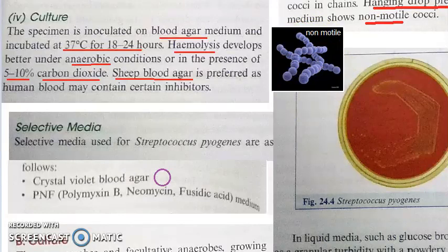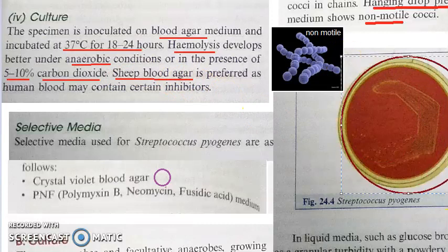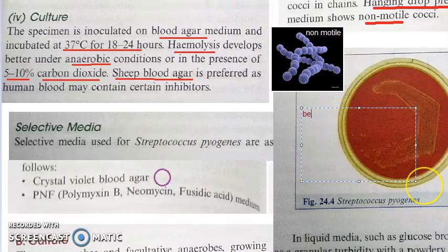Now remember that in classification you have already seen that it comes under beta hemolysis, correct? What does it come under? Beta hemolysis, Streptococcus pyogenes. So beta hemolysis you should see. Where is beta hemolysis seen? On sheep blood agar, it is preferred. So you can draw this type of a diagram showing beta hemolysis of Streptococcus pyogenes. This is beta hemolysis on sheep blood agar, okay?